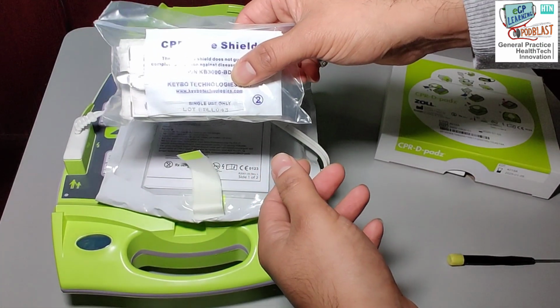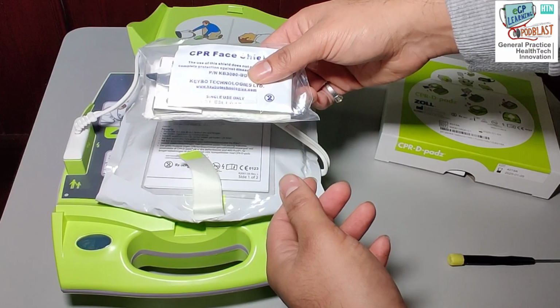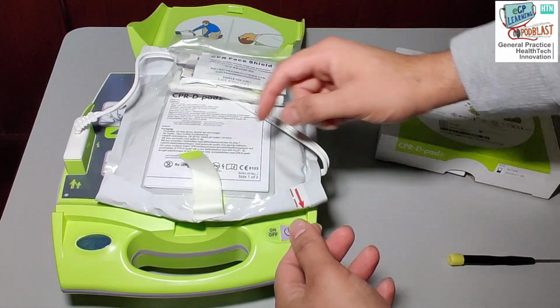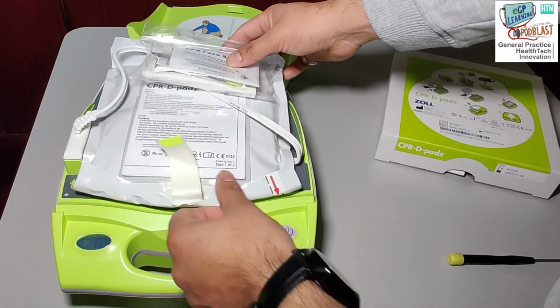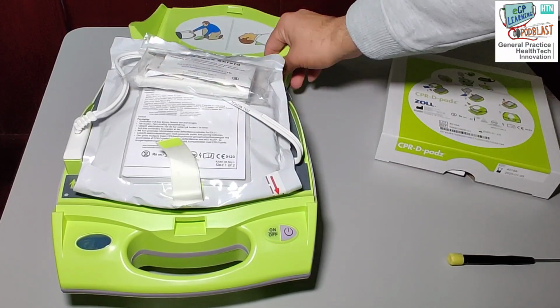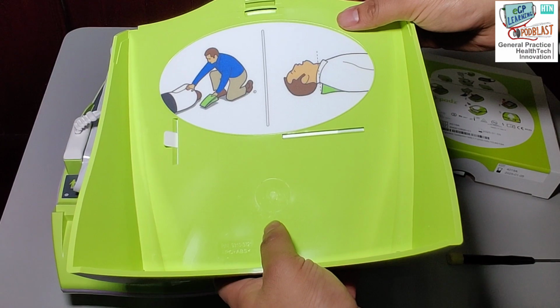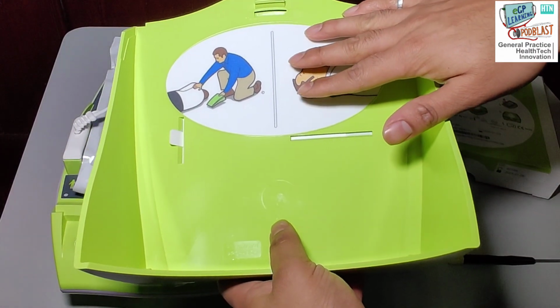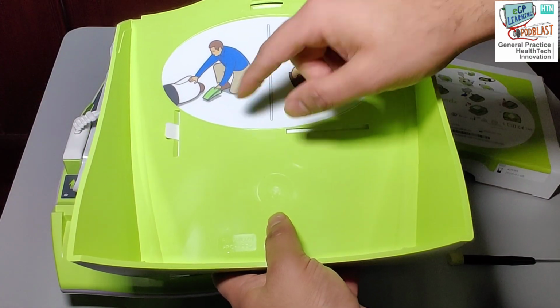I have separated this from the pads packet itself purely and simply because it makes it easier to place into the device. To put the pads in, you simply connect up the cable, slide it into place, and as I said, I found it easier to keep this towards the back, where's the deeper recess of the lid. Important thing to note with the lid, this can be used in a rescue situation to support somebody and turn them over in terms of either opening the airway or to put them into a recovery position.